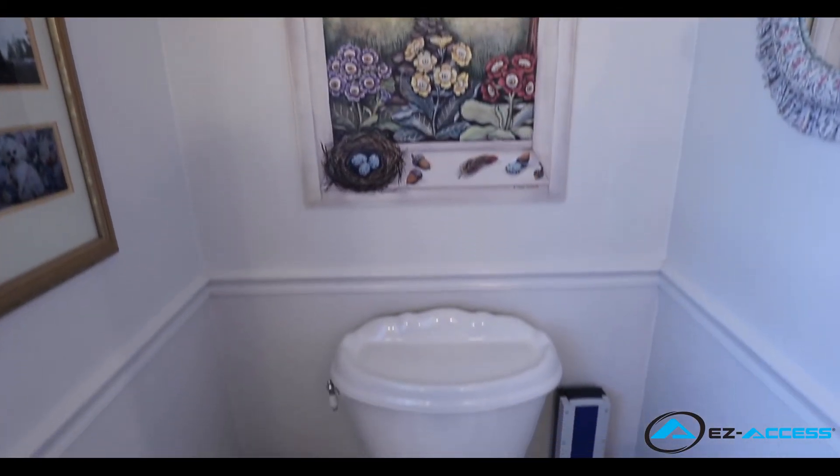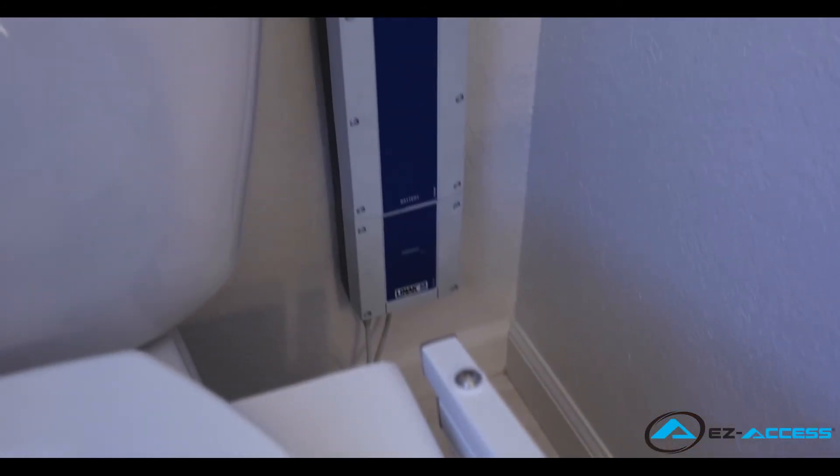Congratulations, you have successfully completed your battery powered tilt toilet incline lift installation.